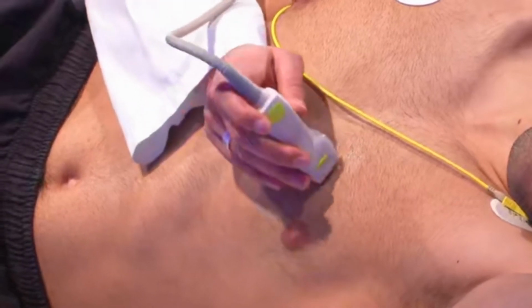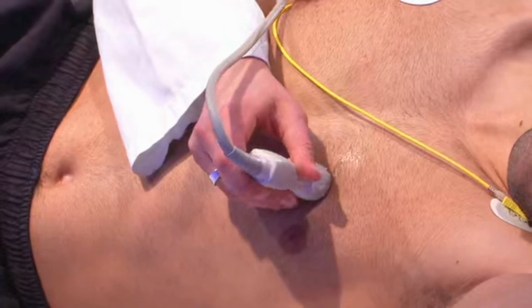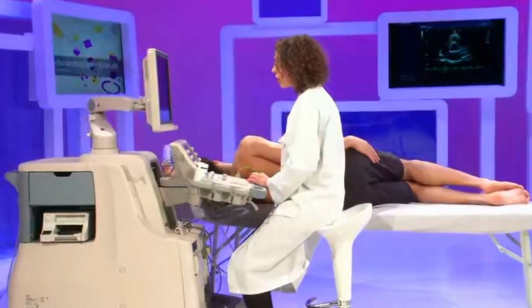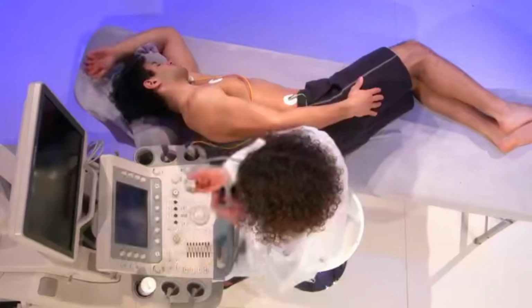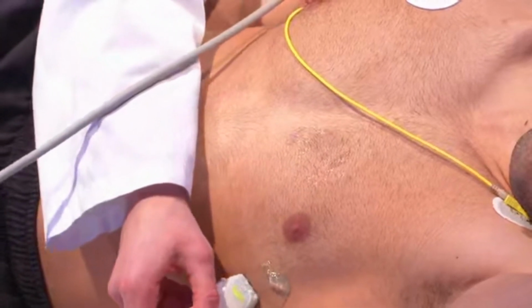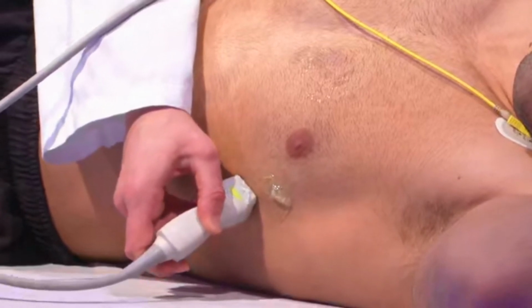In short axis view, I can sometimes acquire an M-mode, but it's not currently recommended to have an M-mode of the aortic valve or the mitral valve, so now it's not recommended anymore. So I will move to the apical view again in order to assess the tricuspid annular excursion and the mitral annular excursion.